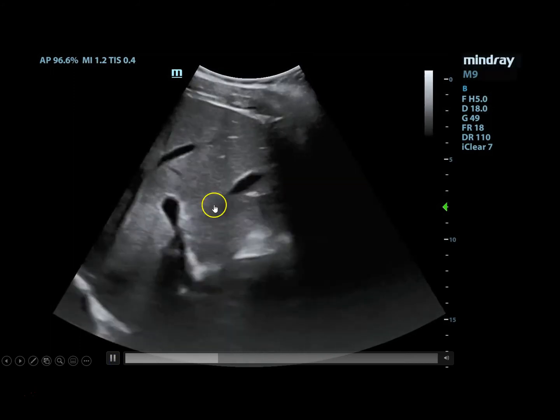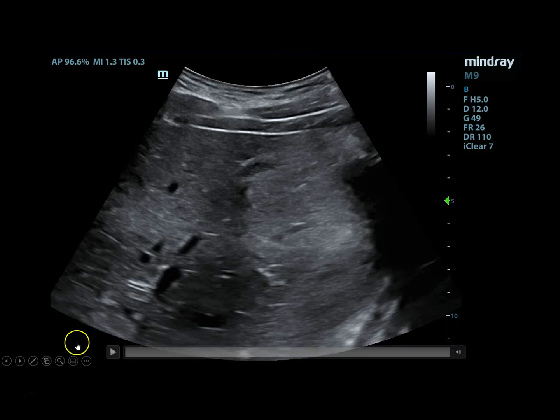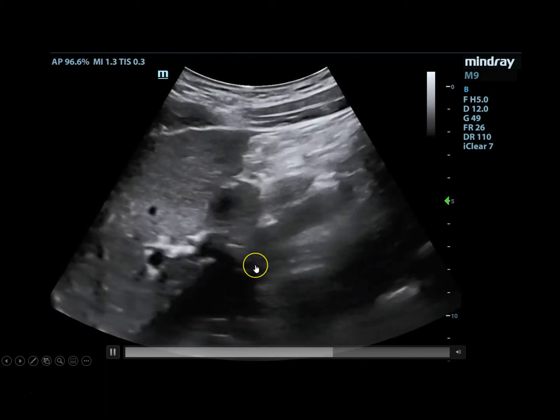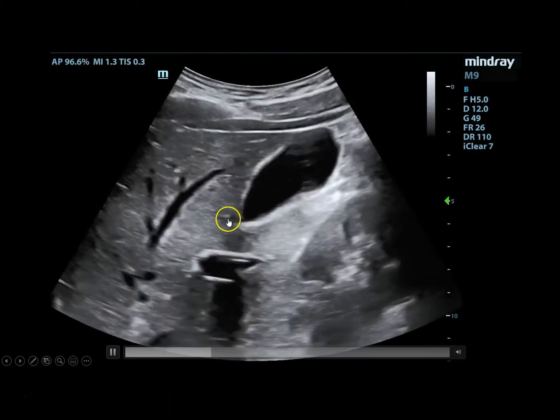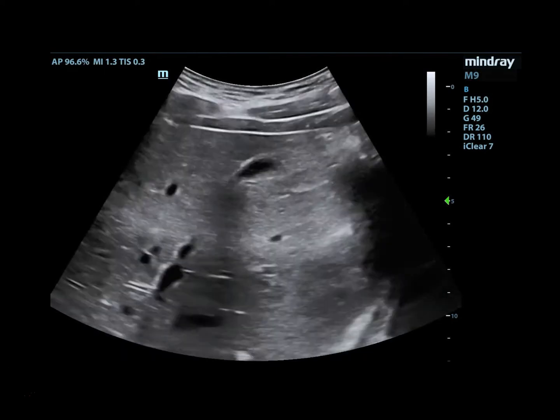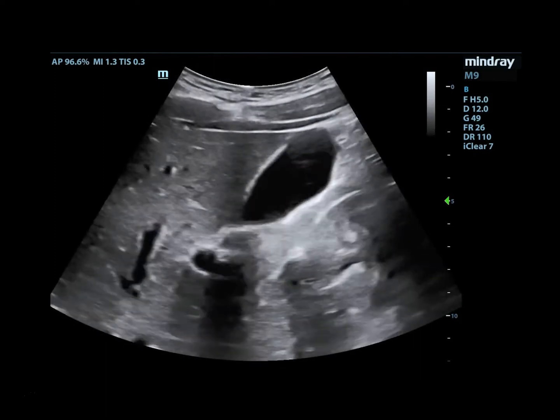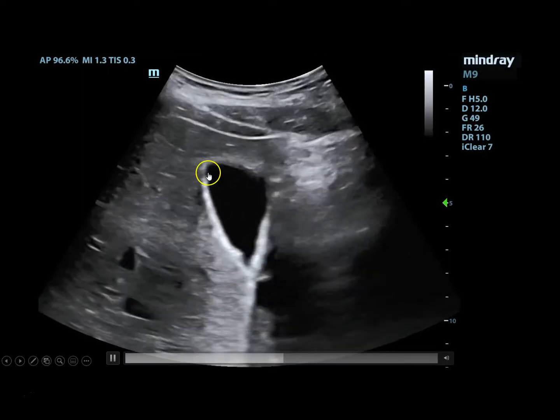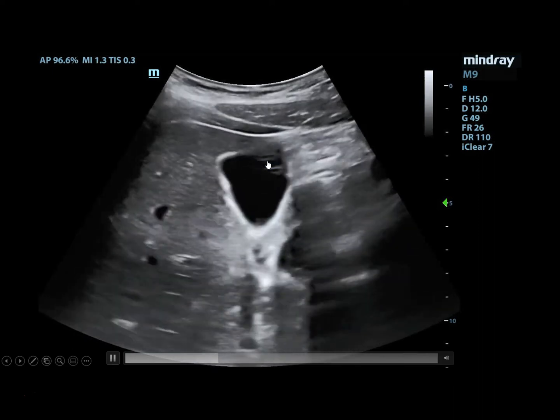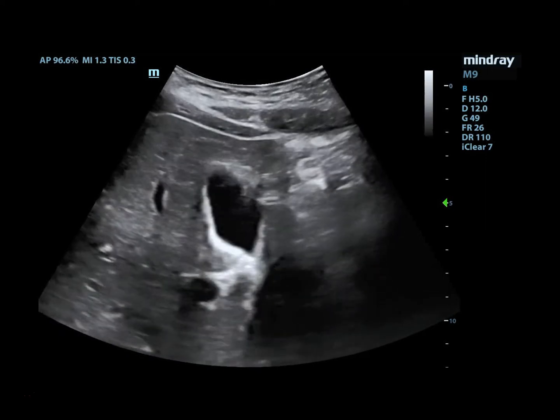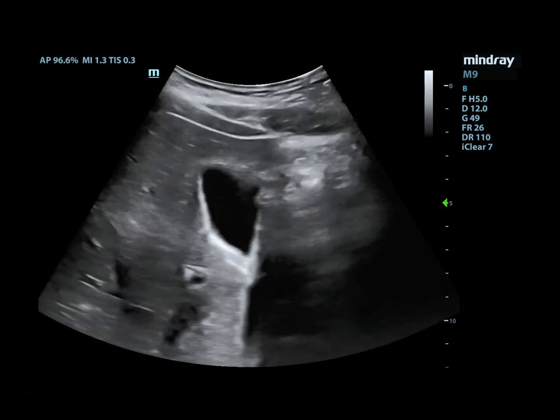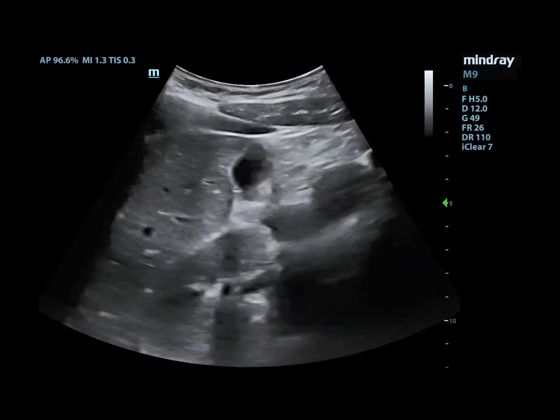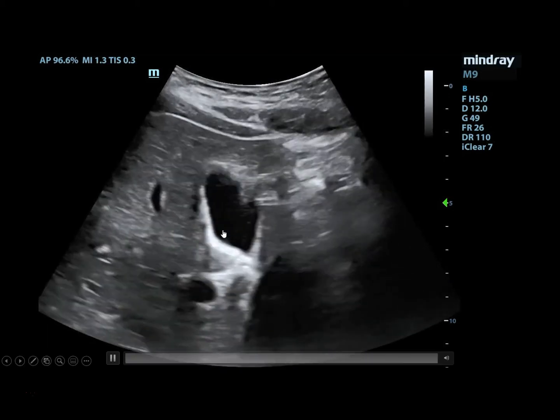That's what the gallbladder looks like as they sweep through. They perform a long-axis view showing the entirety of the gallbladder, sweeping through to the neck of the gallbladder — a frequent spot of missed stones. After the long-axis view, they rotate the probe 90 degrees towards patient right and get the short-axis view: a more squat, foreshortened image, again sweeping through the entire area including the neck. In this situation, you're looking for a gallstone — a bright, hyperechoic structure that causes shadowing right behind it.